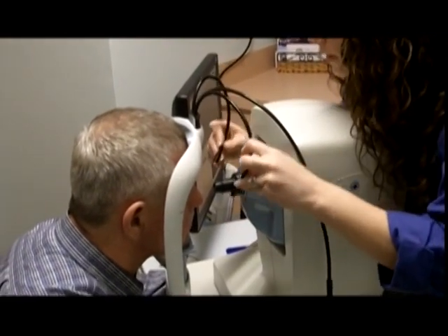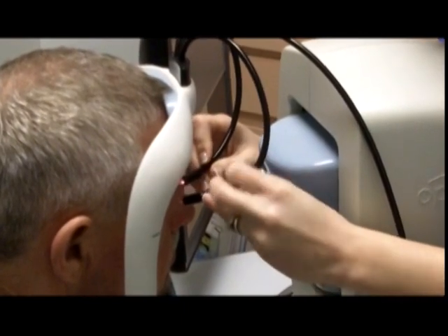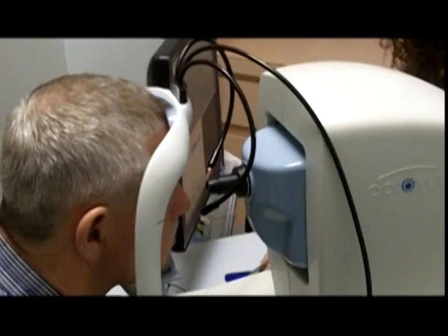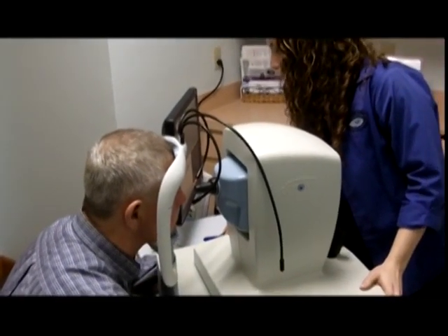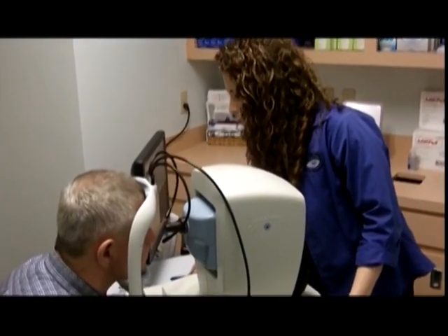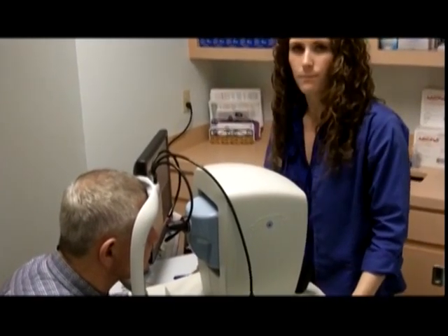I'm going to bring in my corneal illuminator lights and put them close to the patient's eye to light it up. Then I'm going to get the screen ready to do my cross line and line scans so that we can evaluate the contact lens.